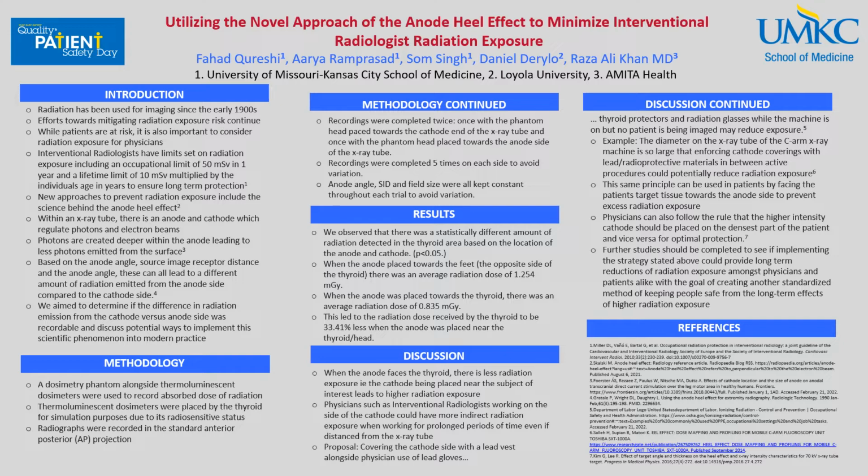In this study, we aim to determine if the difference in radiation emission from the cathode versus anode side was recordable, and also discuss potential ways to implement this scientific phenomenon into modern practice.